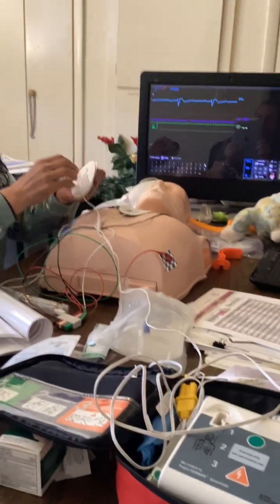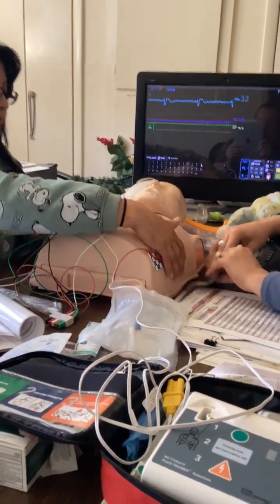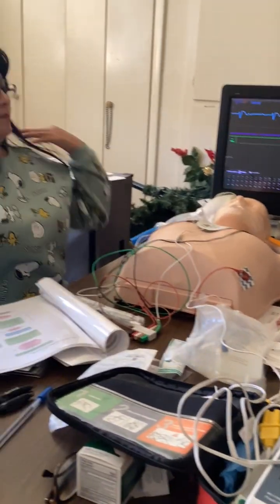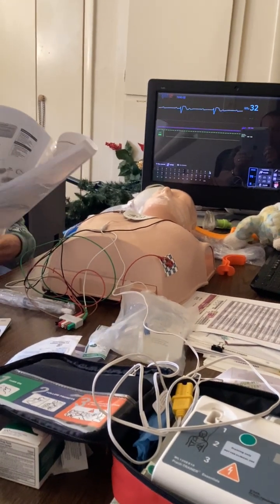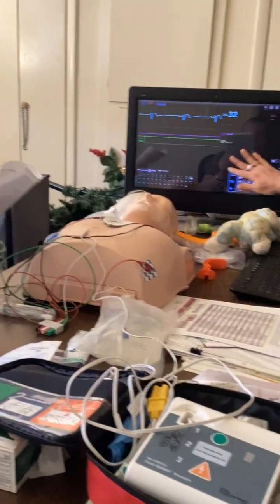What's the timing? We are at 15 minutes. I'm going to roll them over. So let's just say we rolled them over and that one's stuck. So let's just say we gave the atropine for this heart block. Did it seem to be effective? No. So let's get ready to pace them. So the pads are on. So here's your pacer over here.